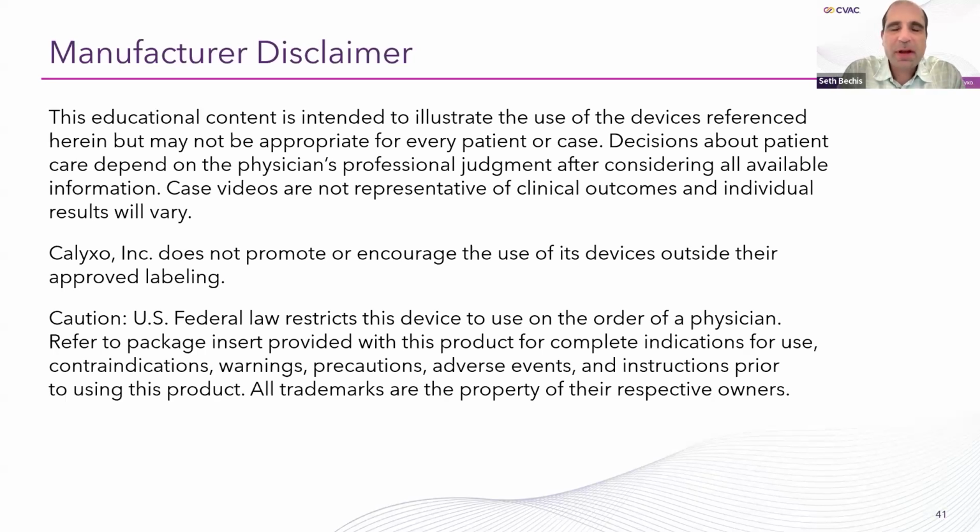But even in patients who have not been pre-stented, if you can place a 12 French sheath for this device, or even not use a sheath at all and just place the CVAC device on its own, we're headed towards a world where we may not have to leave stents even in those cases. And that's great. Yep, that's a great segue to the next question, which is, any tips that you can share to place an access sheath in an unstented patient?